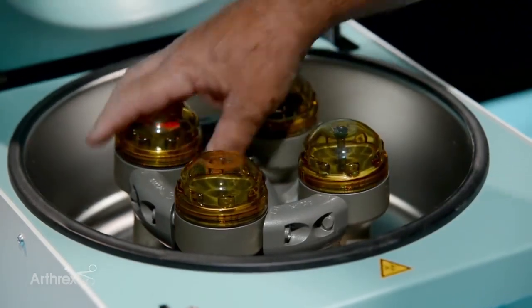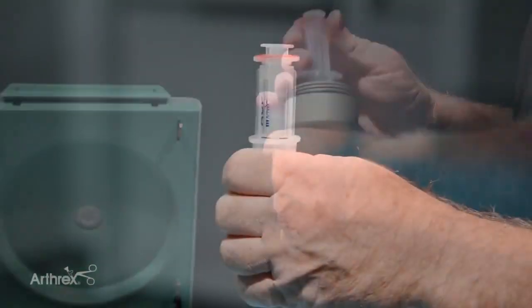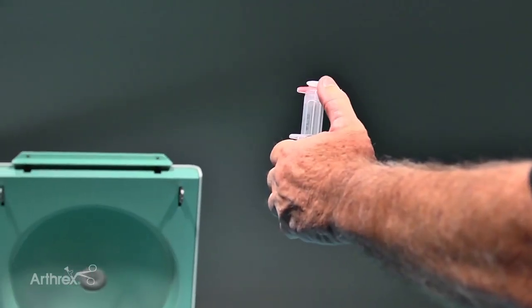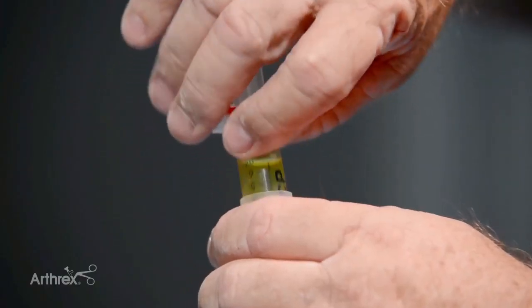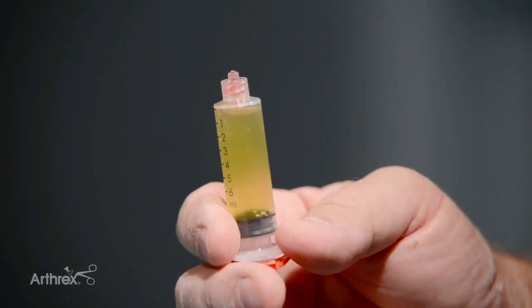Okay, so then after the centrifugation, go ahead and get your product. We're going to go ahead and push down on the red and pull up on the inner tube. You go ahead and unscrew it and then use it at the point of care, or you can freeze it up to 6 months.